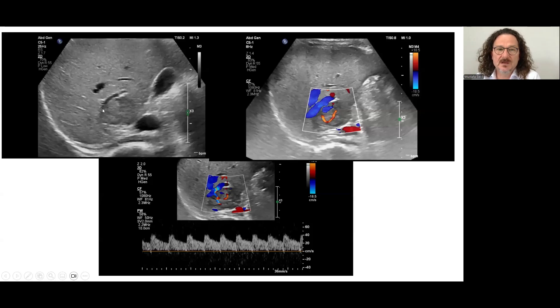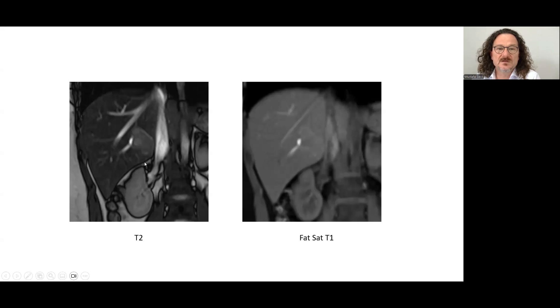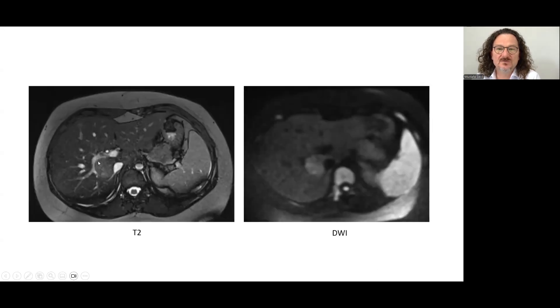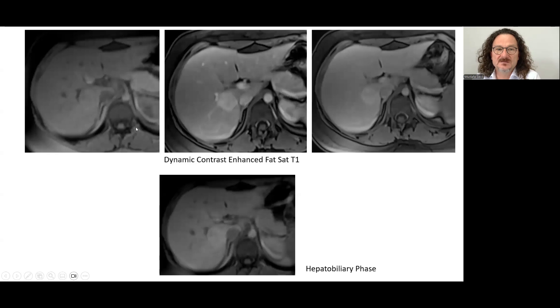Another example: a slightly hyperechoic lesion with a central feeder artery and low resistance flow. On MRI, the same lesion is slightly hyperintense on T2 and almost isointense on T1, with very slight diffusion restriction. The enhancement pattern shows early arterial enhancement and persistent enhancement in the late phase. This case also demonstrates the hepatobiliary phase enhancement pattern, where the lesion is more enhanced than the background parenchyma.